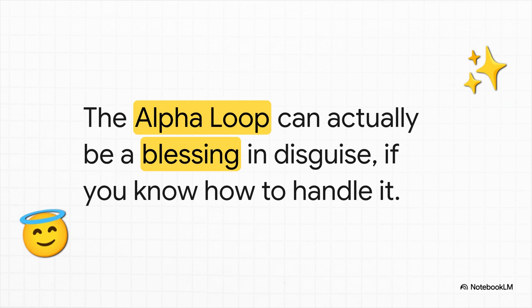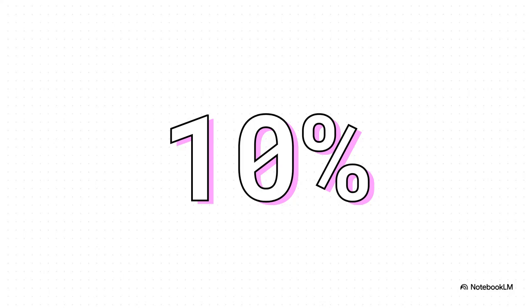And this is where things get interesting, because believe it or not, this one can actually be a good thing. This is the alpha loop, and just recognizing it can save you a ton of time and effort. An alpha loop is pretty rare. We're talking it only forms in about 10% of cases. It usually happens when the sigmoid is on a nice, long, flexible mesentery, which lets it twist easily without creating one of those sharp, painful bends.